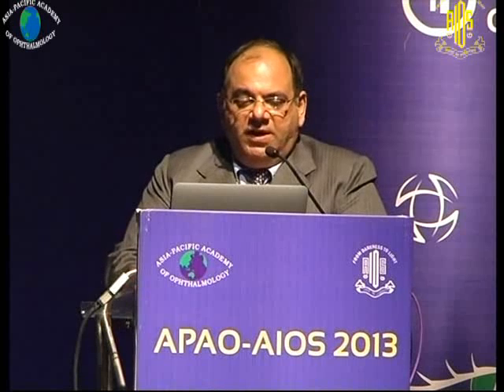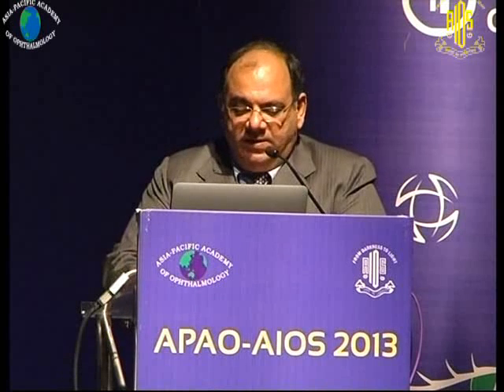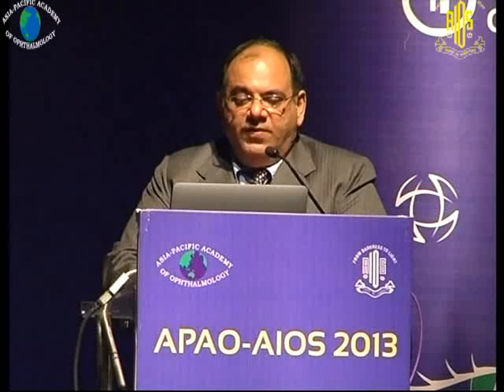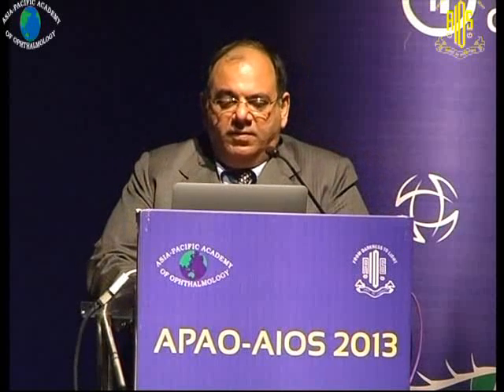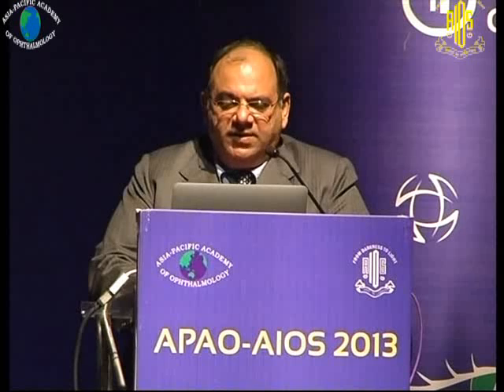I personally like to use the approach of stretching for small pupils rather than iris hooks, because we find them more traumatic, as you see in this diabetic combined procedure with a relatively hard cataract and a very small pupil.